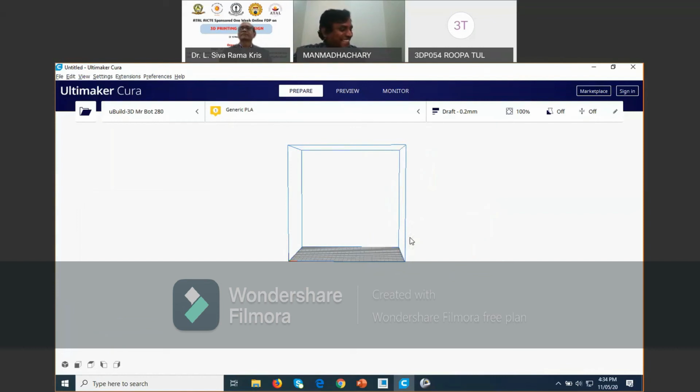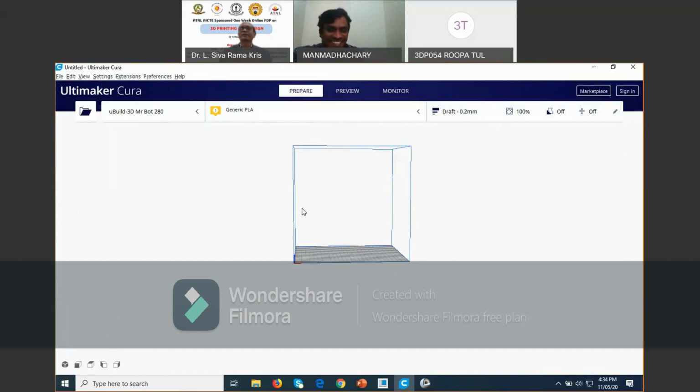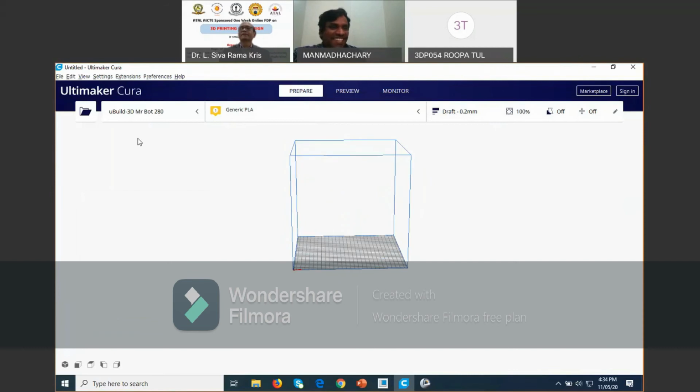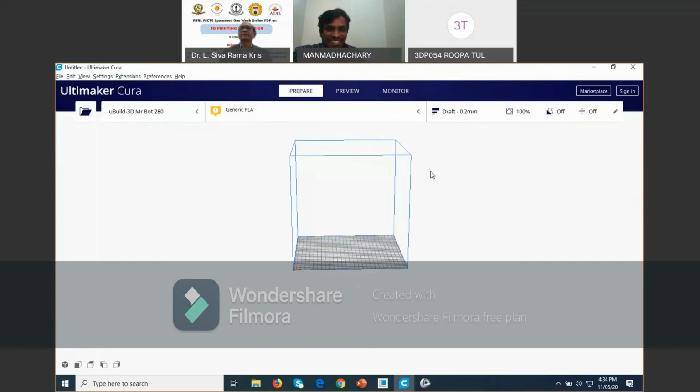It is taking 2 days to print. How to reduce this, sir? When the size is bigger, the printer will take 2 days. Sometimes it will take 3 days also. You have to give it and it will print continuously. That's how you have to do 3D printing. Got it. It can be done in 10 hours to produce the part.